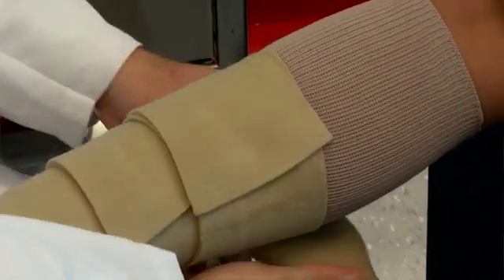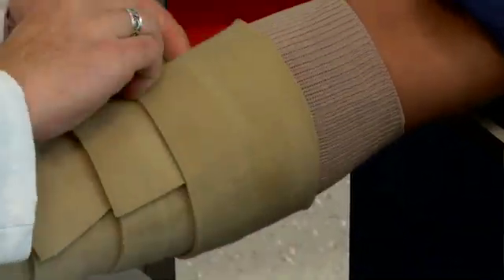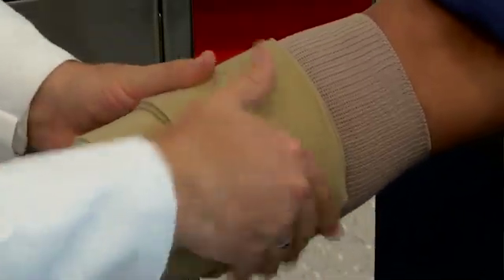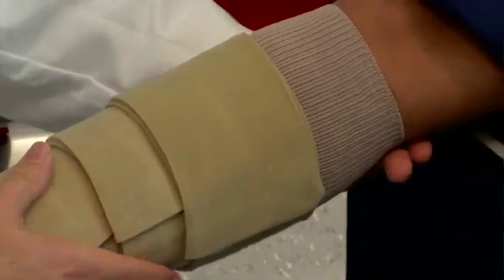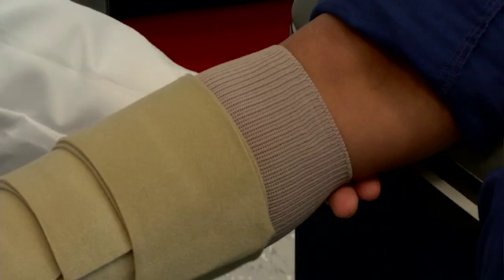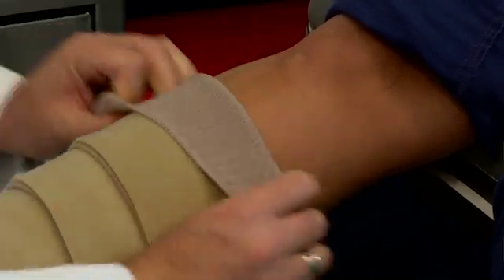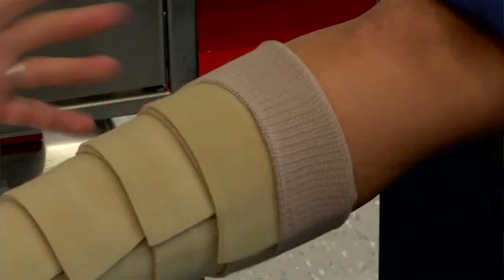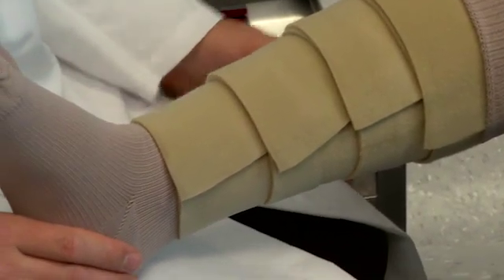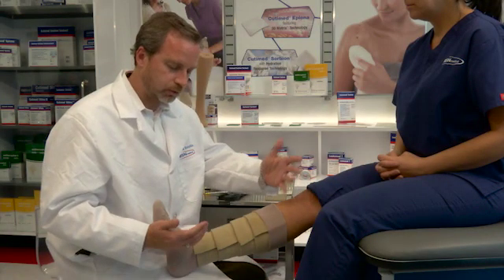The Basic is therefore the easiest garment to apply properly with one hand. Again, you would work your way up the leg, applying the tab at or near end stretch and then the top layer at or near end stretch. Ideally, the garment will be applied such that the top is two finger-breadths below the back of the knee. This garment is slightly short but still adequate. Any excess fabric can be folded down on the leg, and then the garment can be worn throughout the day. The Farrah Wrap Basic comes in five sizes, and additionally there are five extra-long or tall lengths.